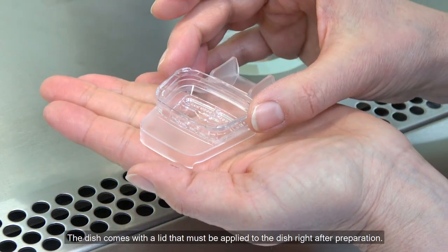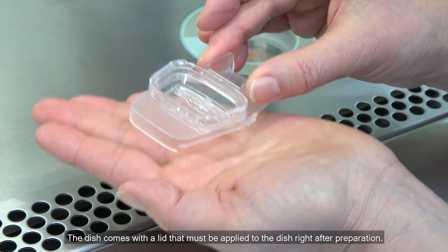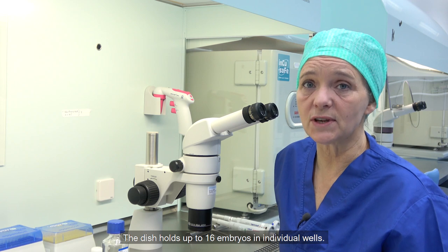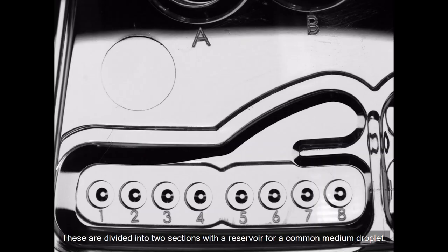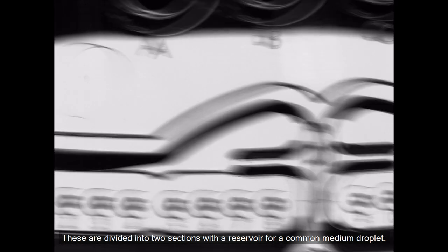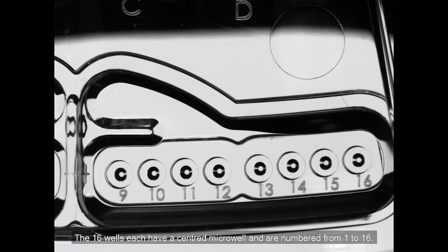The dish comes with a lid that must be applied to the dish right after preparation. The dish holds up to 16 embryos in individual wells. These are divided into two sections with a reservoir for a common media droplet. The 16 wells each have a centred micro well and are numbered from 1 to 16.